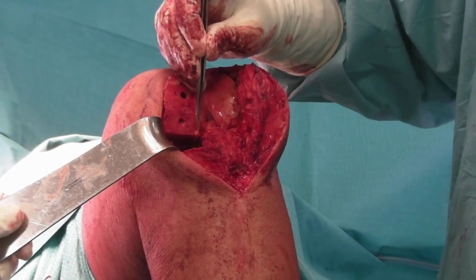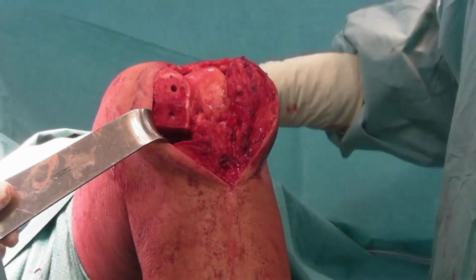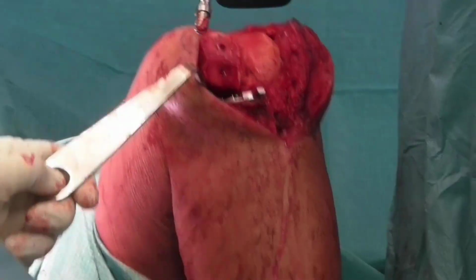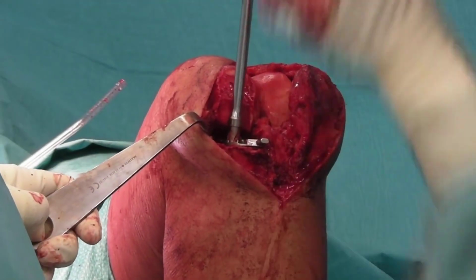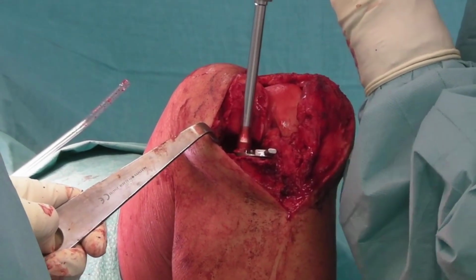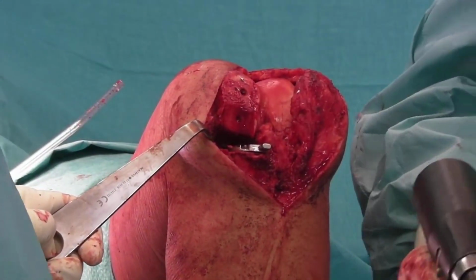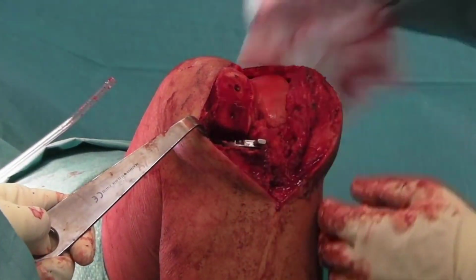As we have already seen for the tibia, after completing the bone cuts, the fragments are removed, leaving a flat and smooth surface, ideal for subsequently accepting the prosthesis. We now come to the point where we use other instruments to prepare the prosthesis bed on the bone.